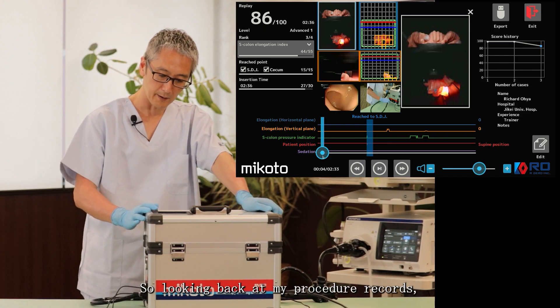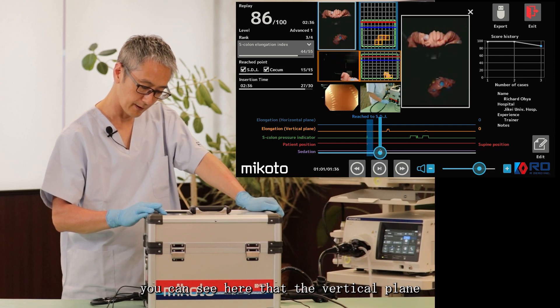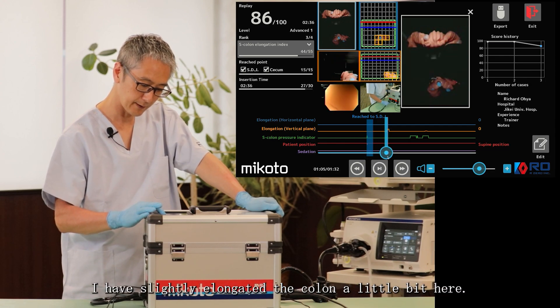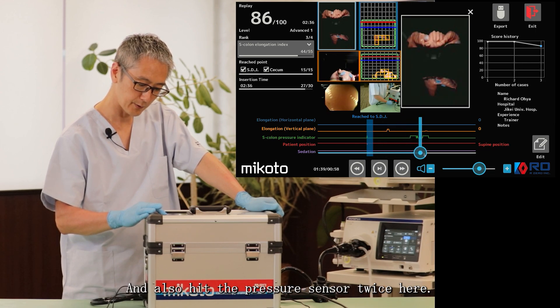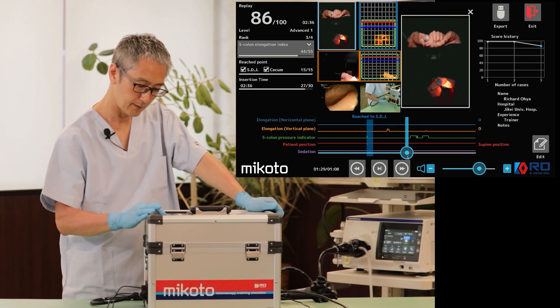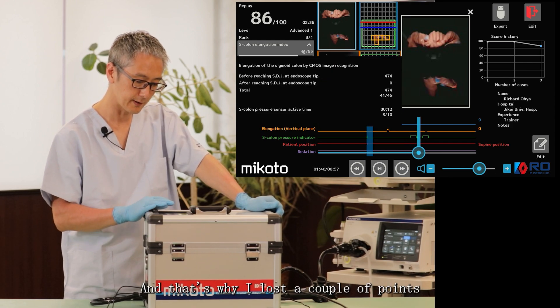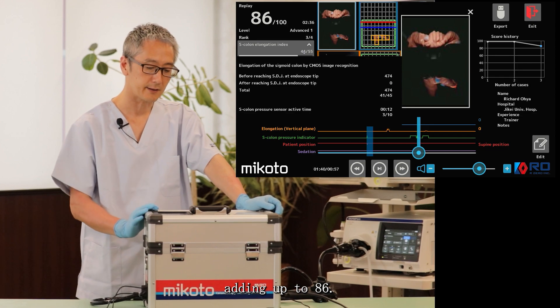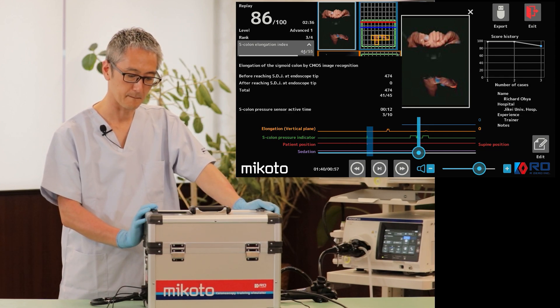Looking back at my procedure records, you can see that in the vertical plane I elongated the colon a little bit and hit the pressure sensor twice, which is why I lost a couple of points, adding up to a score of 86.